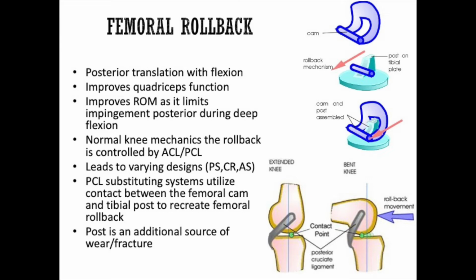impinging. The way that the total condylar knee incorporated this initially was it created a post on the tibia with a cam and bar on the femur with a box cut that you make where the post fits into it. Then as the knee slides, the cam contacts the post, which prevents dislocation but allows for that rollback.